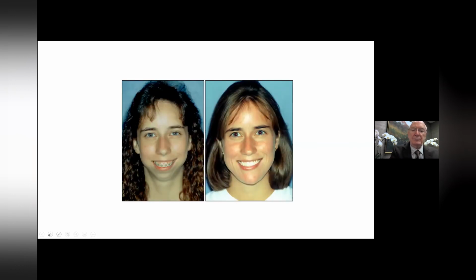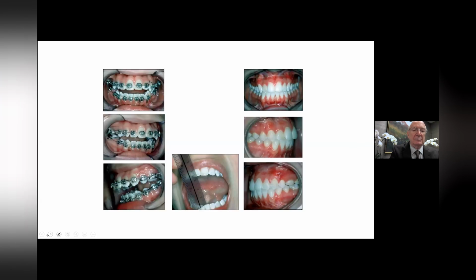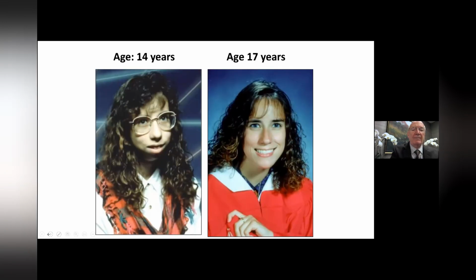And that enabled us to end up with this. And so this is her on the right-hand side, 1 year post-surgery. See the improvement in her aesthetics, her profile, and her occlusion. Good incisal opening, and a very nice occlusal outcome. Very stable, very predictable with this treatment protocol.